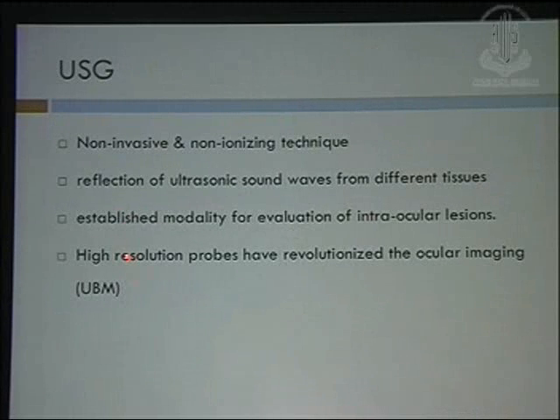Now, this is another simple modality which is most commonly done nowadays, ultrasonography. One of the most important advantages of this is that it is a non-invasive and non-ionizing technique, and thus we don't have any of the complications of ionizing radiation. It can be done in a child also, and in elderly people also.